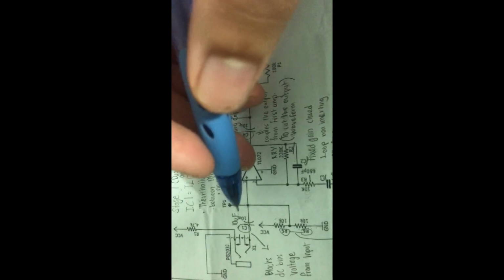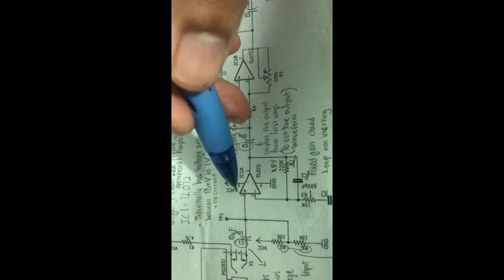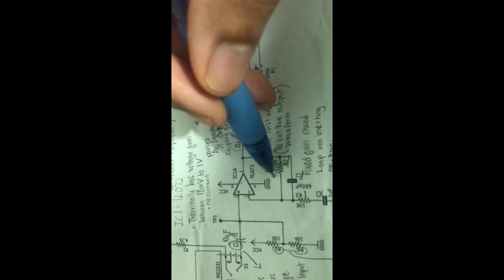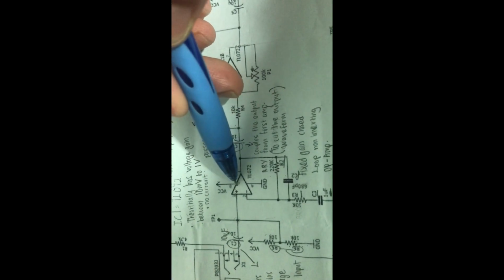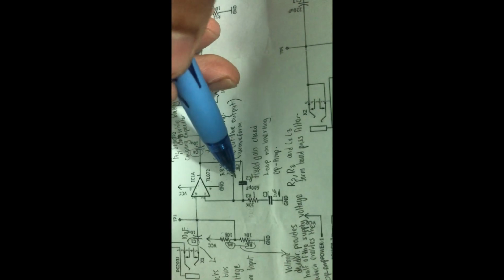Up to that point you can have test point 1. So this is the TL072 IC. This pin is connected to VCC and this one to the ground. This pin, from C1, is connected to the third pin of the TL072, and this is the band pass filter circuit, coming from the second pin and going up to the first pin. Okay, so let's see it in detail.